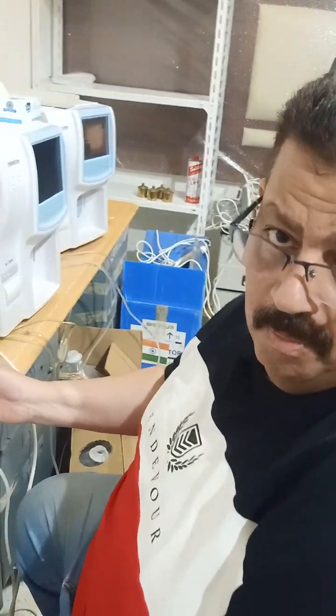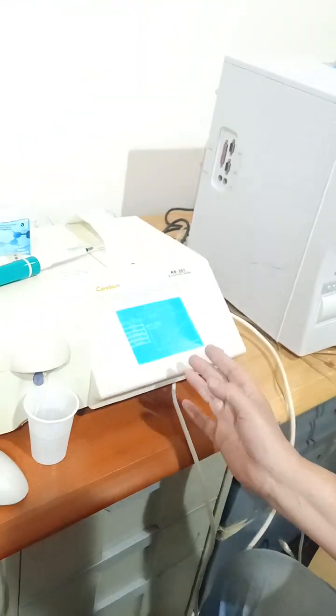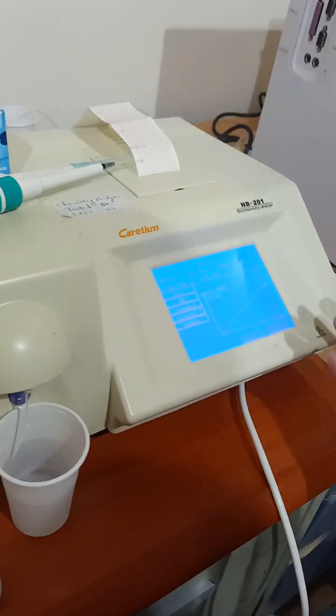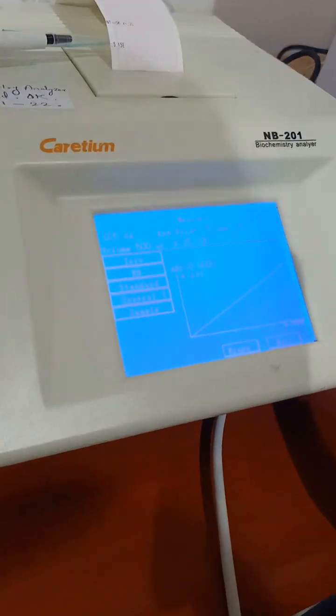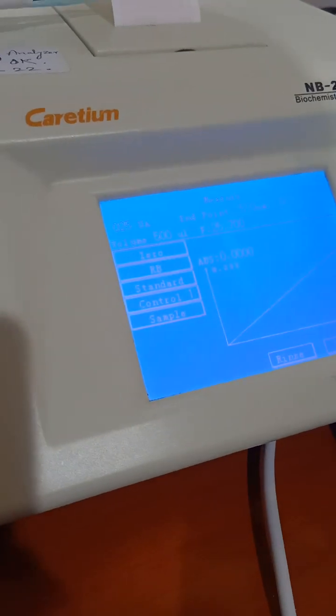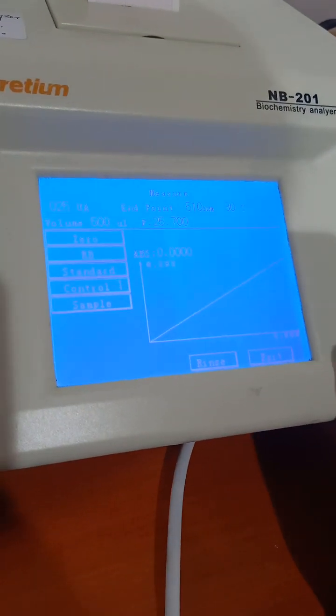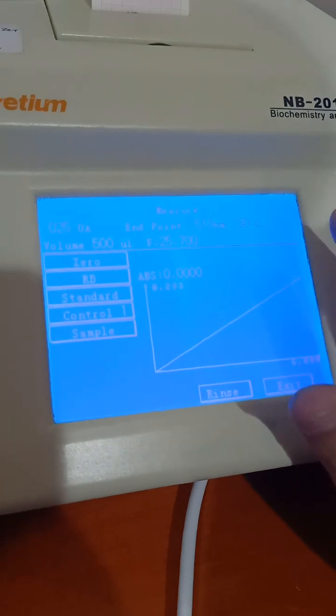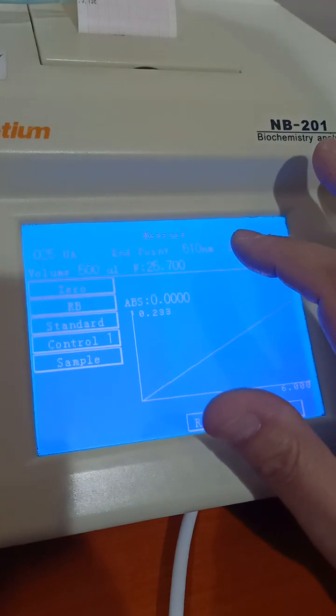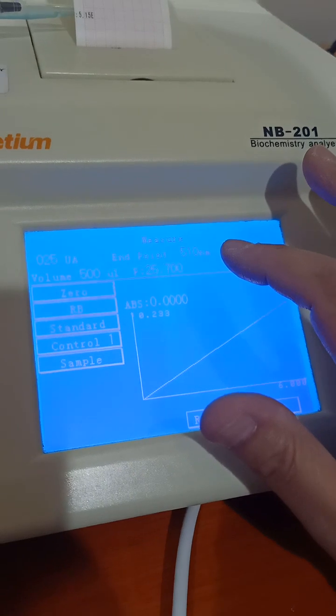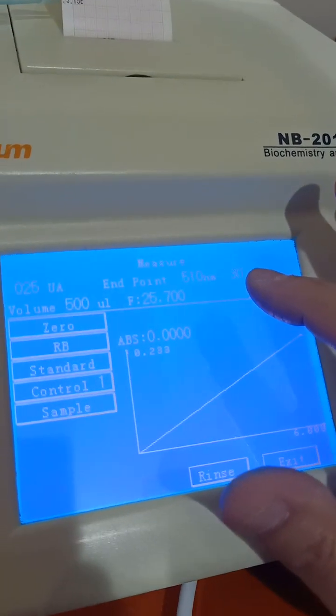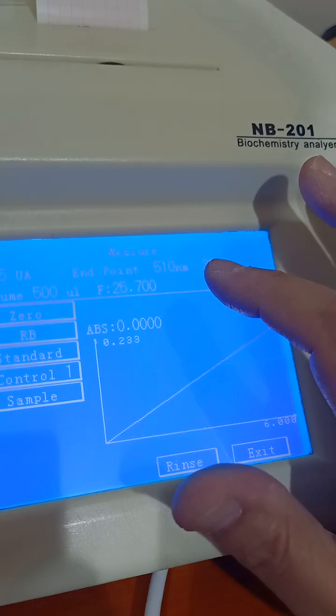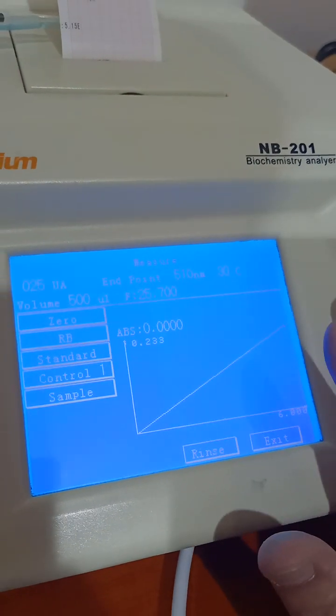Now we are in front of one biochemistry analyzer. This is for determination of some parameters in blood. We already calibrated by using standard filters at different wavelengths for 340 nanometer for example and 546 nanometer and 807 nanometer. And we already finished calibration.